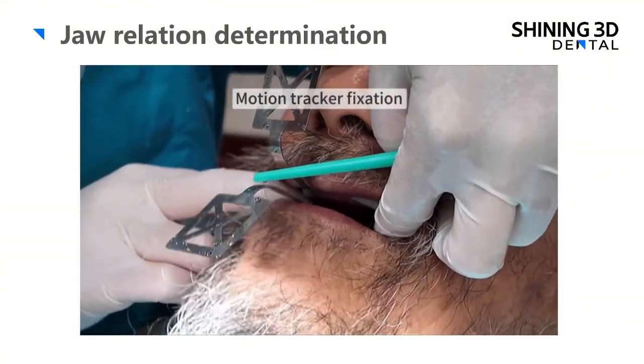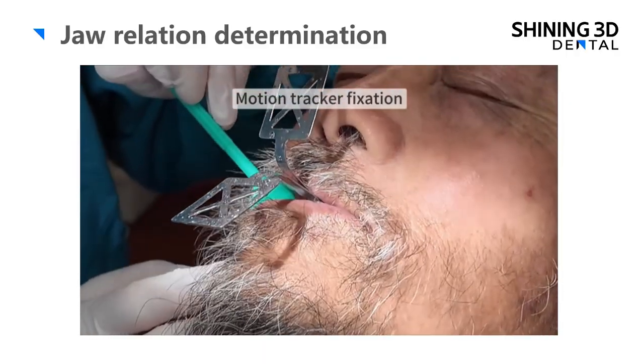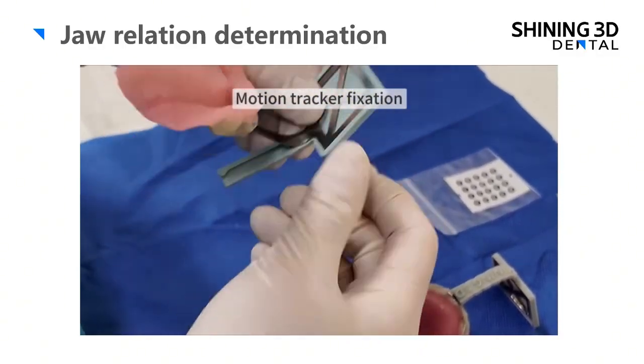Then we put it inside the patient's mouth to check the fitting and make sure it won't block the natural movement of the patient's upper and lower jaw.